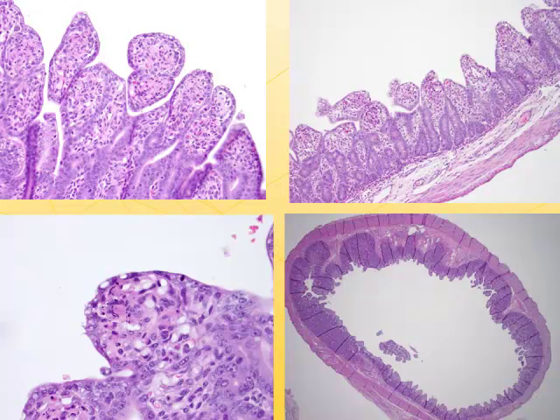A few more pictures of the kind of lesions that we find. We see this necrosis in the tip of the villi caused by the virus. Very severe. Typically, I see these lesions more severe in PED than in TGE and rotavirus, but it will also depend, of course, on the timing of the infection in every pig. And we see that flattening of the epithelium, the vacuolation of the epithelial cells, very characteristic for atrophic enteritis.